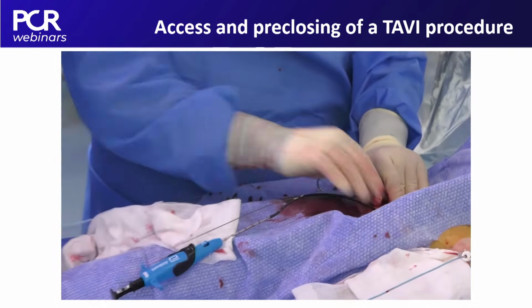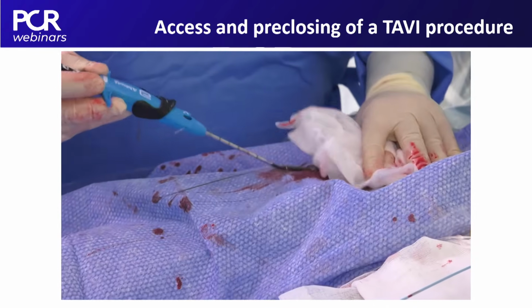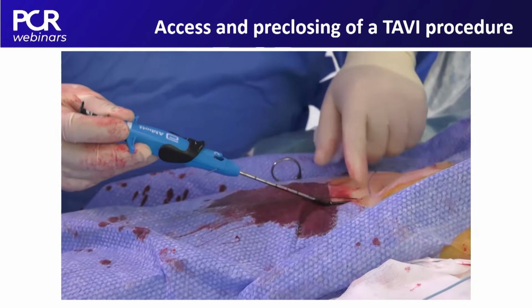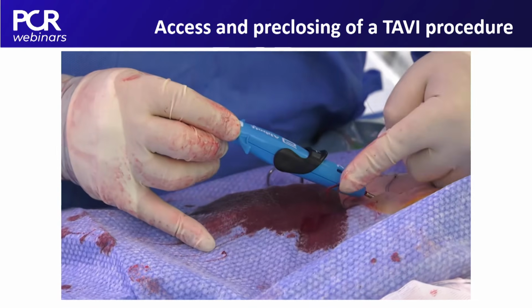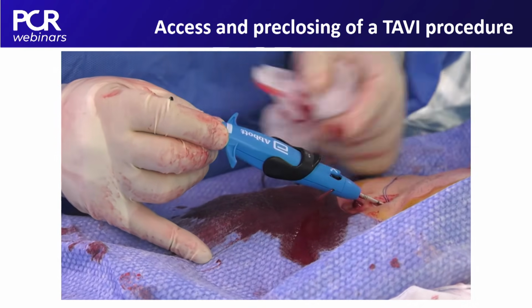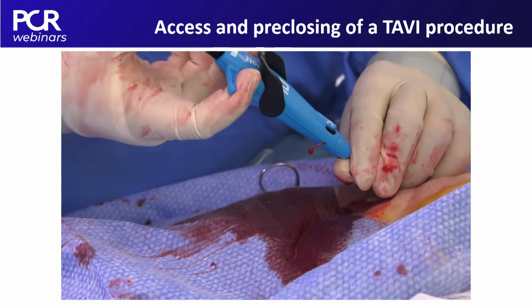So this is the second device. The second device will be deployed again with this 45 degree angle as compared to the patient, or as compared to the floor. But it will be slightly clocked clockwise, so far from the operator, at slightly 1 o'clock. So 1 o'clock, 45 degrees again.